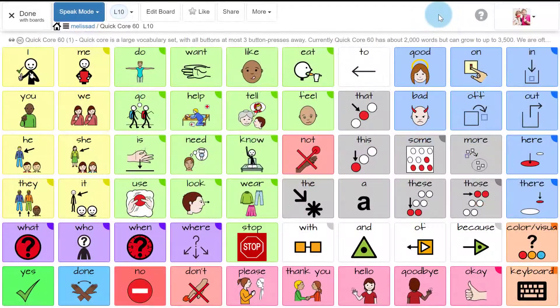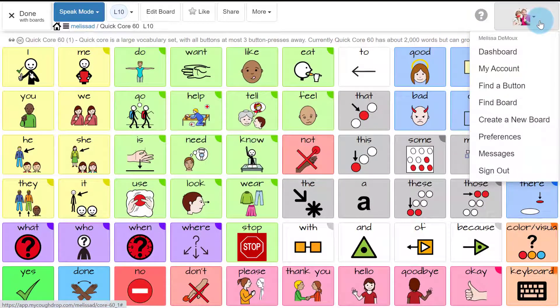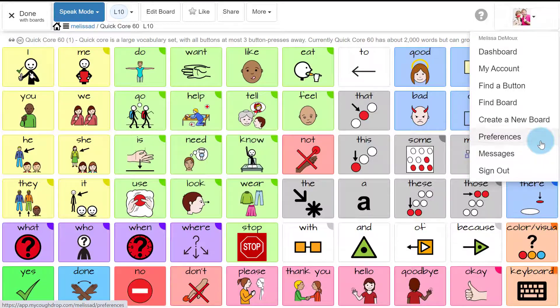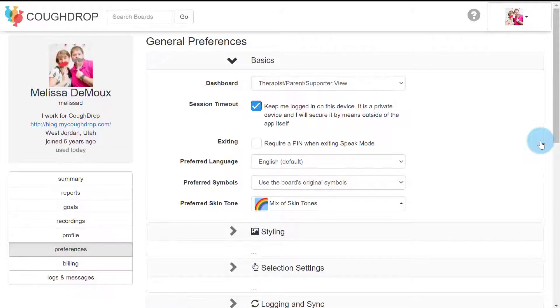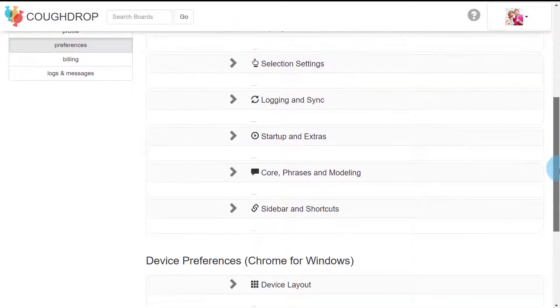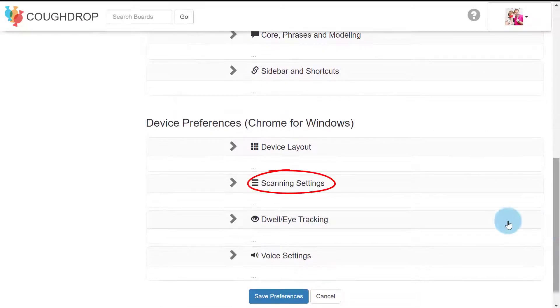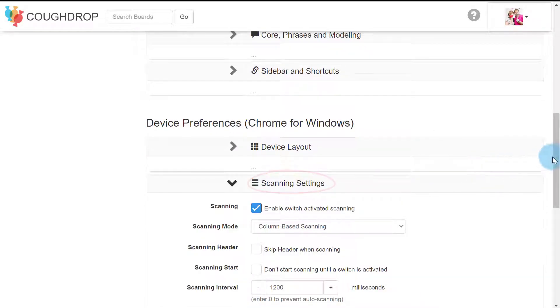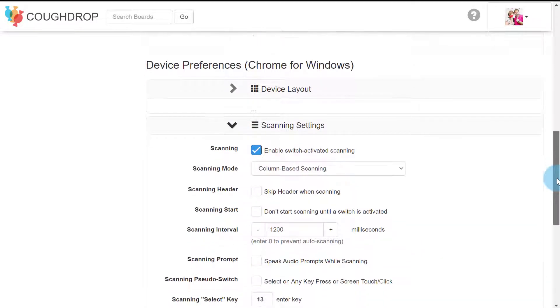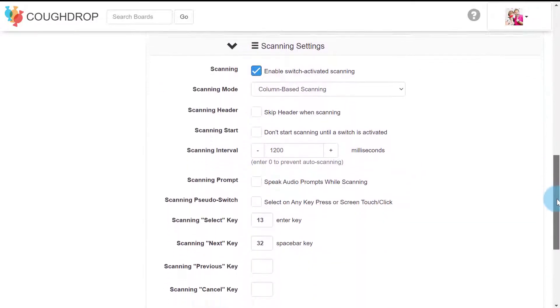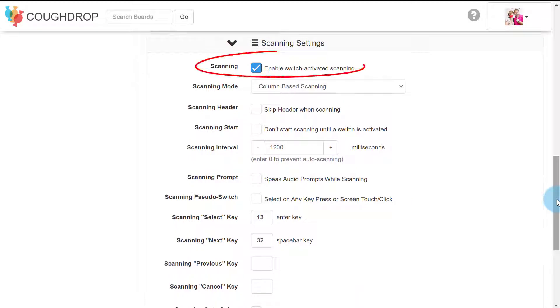To enable CoughDrop scanning mode, open the drop-down menu under your CoughDrop user icon and select Preferences. Scroll down the Preferences page to the Device Preferences section. Watch for the heading labeled Scanning, open that section, and then check the box that says Enable switch-activated scanning.